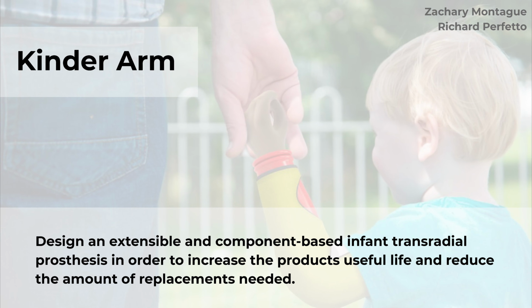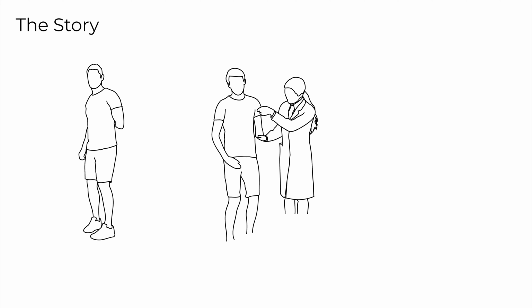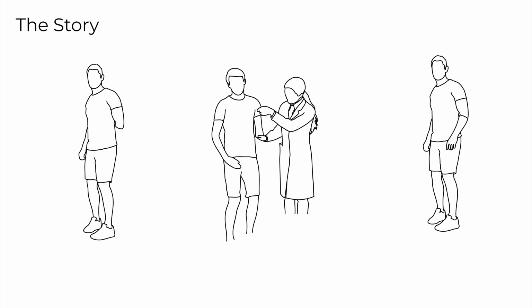This is KinderArm, an extensible and component-based infant transradial prosthesis that increases the product's useful life and reduces the amount of replacements needed. Prosthetics are designed well for adults. Adults with limb deformities are fitted for prosthetics, and those prosthetics are functional to the patient for a few years until they need to be repaired.